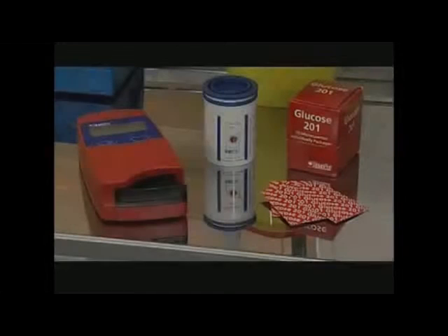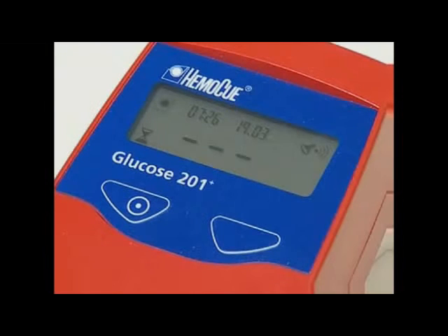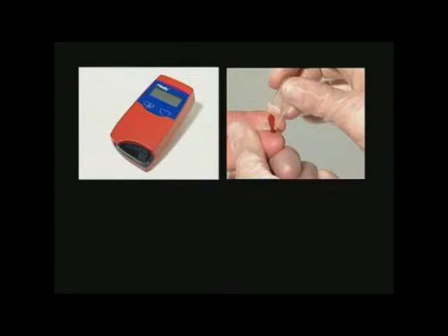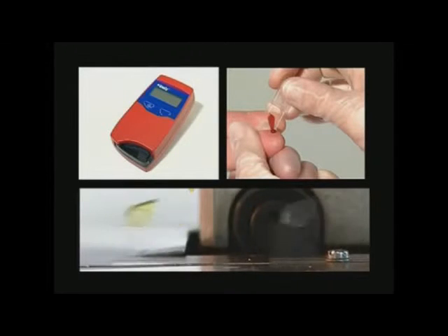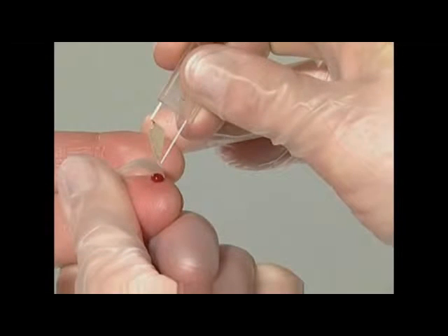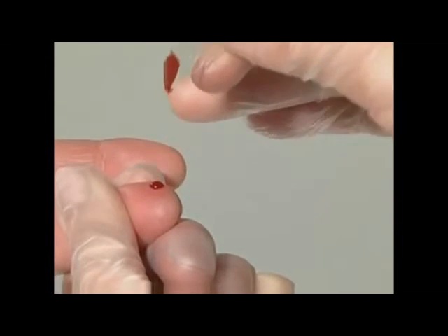The HemaQ Glucose 201 Plus is a system for the determination of the total amount of glucose in whole blood. The system consists of a specially designed analyzer with specially designed micro cuvettes containing dried reagent. The micro cuvette serves as pipette, reaction vessel, and as a measuring cuvette.